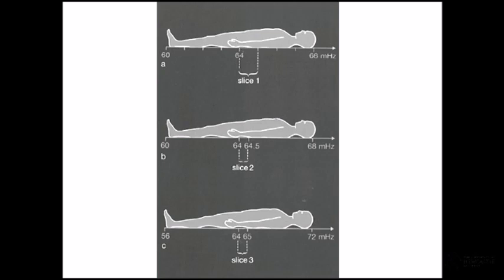Just showing that's our isocentre. What happens when we put someone on the table is we pick a centre point. If we're going to scan someone's brain, the centre point is the glabella. So we put them in the scanner, turn a laser light on, and move them through to that laser light being on the glabella. That's our centre point, then we push them into the scanner. That becomes 0. This is all positive, this is all negative. Does that make sense? So then we know that's our isocentre.